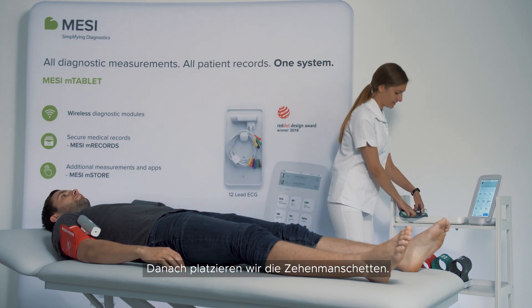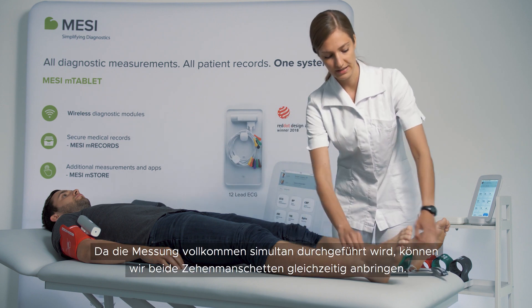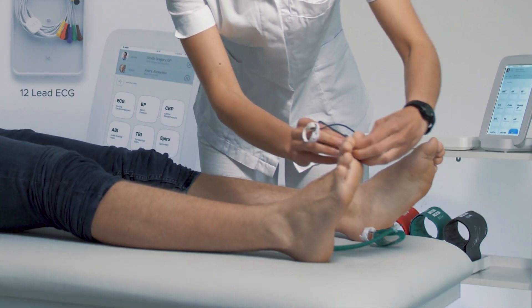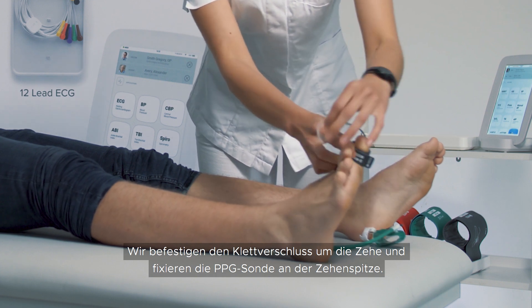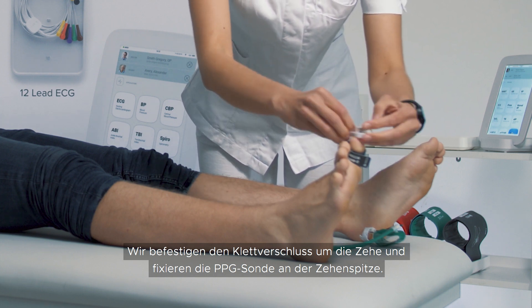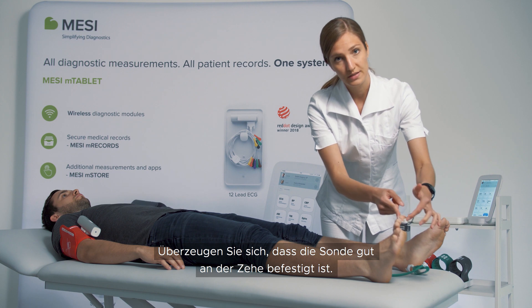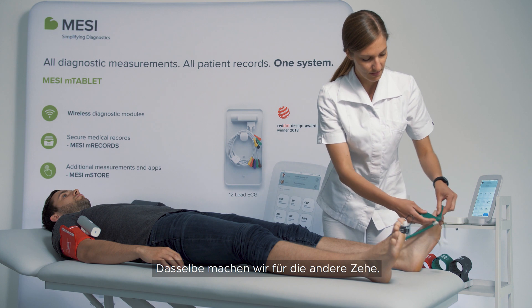Then we will place the toe cuffs. Because this is a completely simultaneous measurement, we can place both toe cuffs at the same time. We fasten the velcro around the toe and we place the PPG probe on top of the toe. Make sure that the probe and the toe come into good contact. We do the same thing on the other toe.